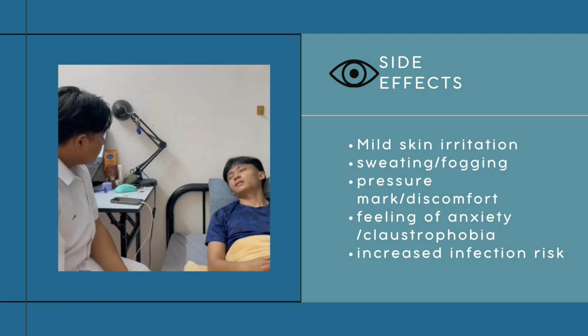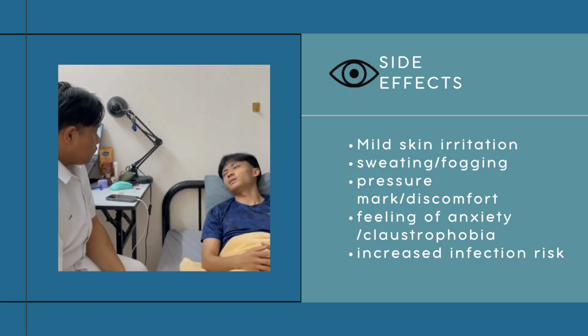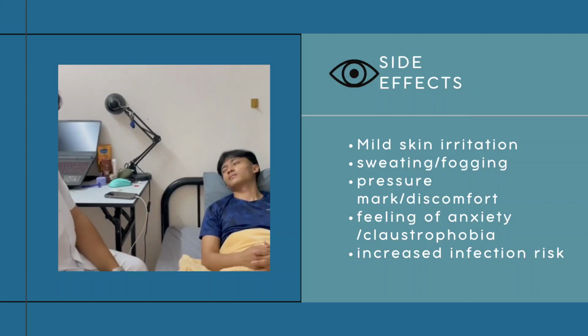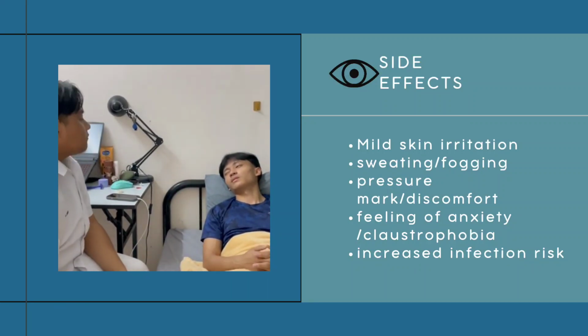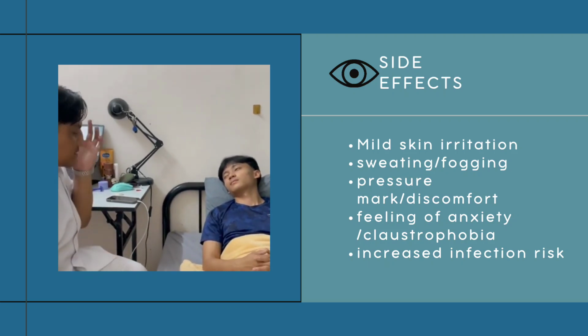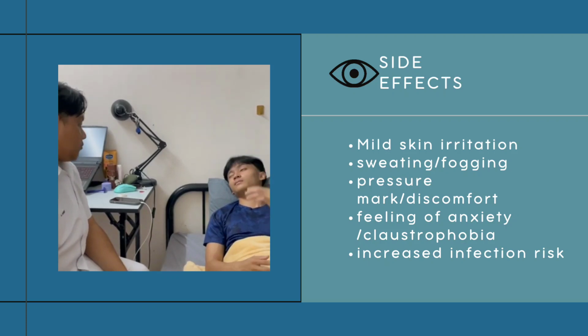Okay, I want to ask, since you just started using this eye shield, right? How long will I use this eye shield? Is it about a week, a day, or maybe a month? Alright, so it's a nice question. Of course, it is less. So I suggest you wait for about a week. If you notice any changes to your eyes' appearance, such as redness, swelling, or discharge or pus, then you need to contact your care provider immediately.